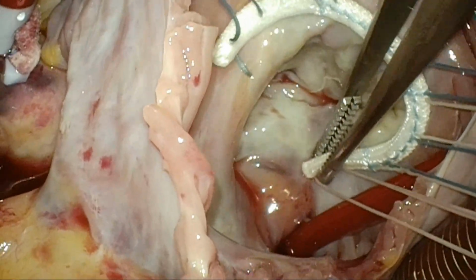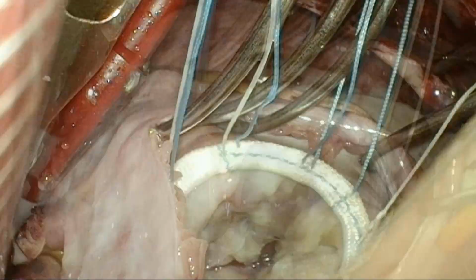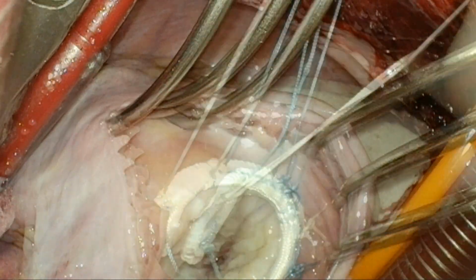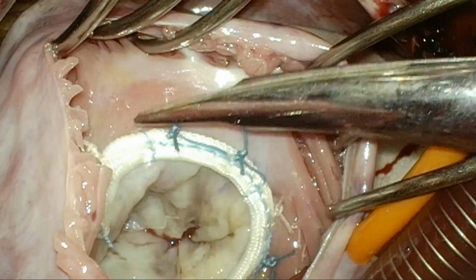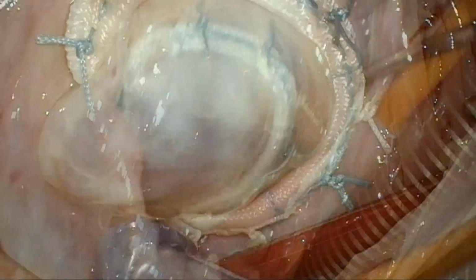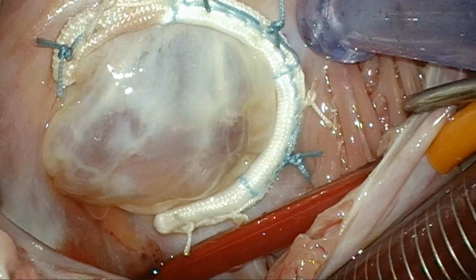So you have a rigid component where you need the remodeling to happen, and you have flexible components where you want to avoid injuring structures around, because that part of the septum or the membranous septum is very vulnerable to injuries and tears, etc. So that's how it looks. That's a perfect tricuspid repair. We do it, as I said, on an arrested heart. You can do it before or after the mitral, it doesn't matter.